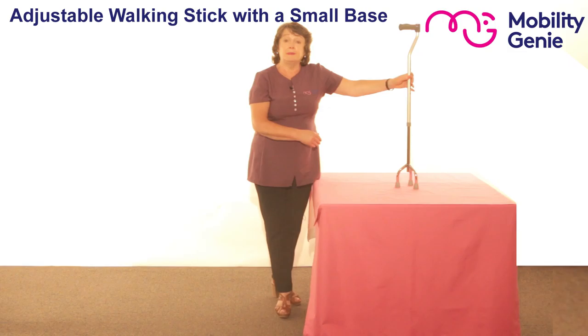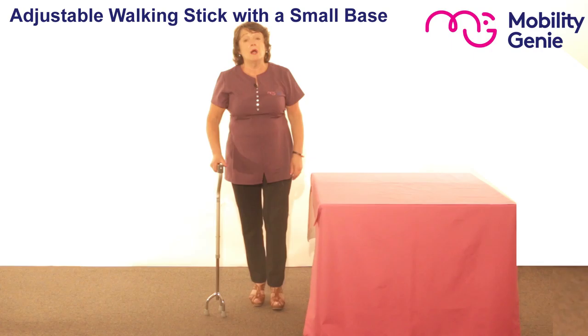It's adjustable from 27 inches to 37 inches. For any other information please refer back to the page. I'm just going to place it beside me to show you how to measure somebody for a tripod or a walking stick.